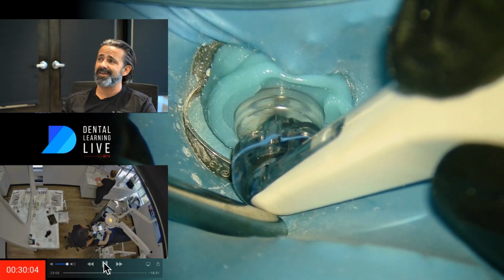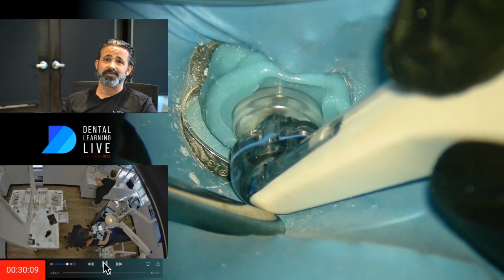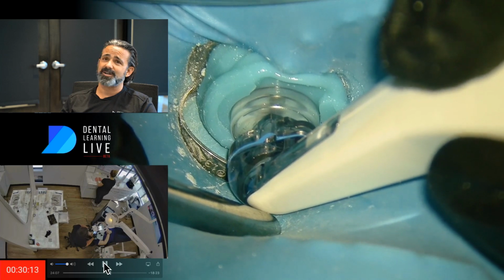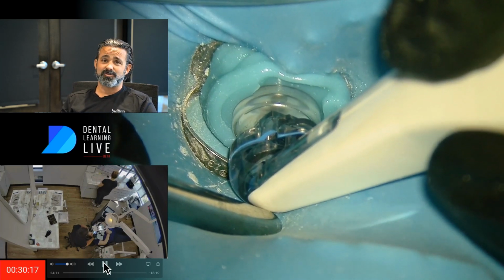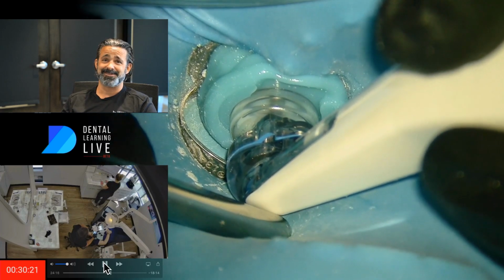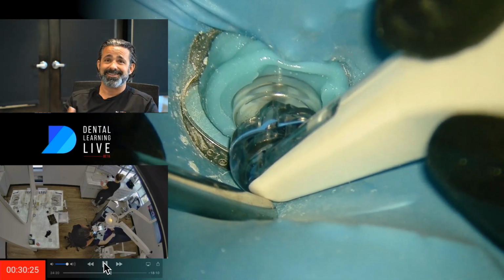But for the most part, most of the time, it's just smooth sailing, and unless I'm looking around the room and I move my hand, it's quiet and dry. And then you can just go off to your happy place or talk to your patient or tell funny jokes. I think the GentleWave tries to make us funny because we don't know what to say during this time as endodontists. We just gesture and we're always doing, and now we're just waiting and watching.